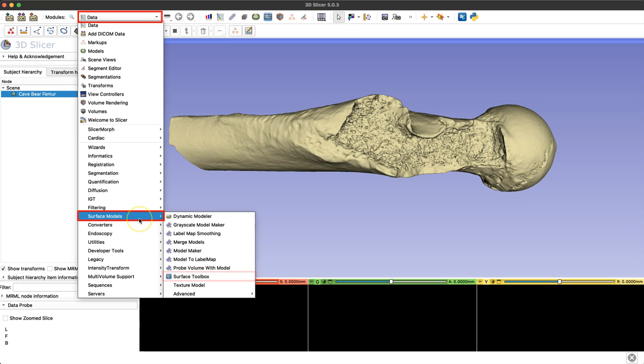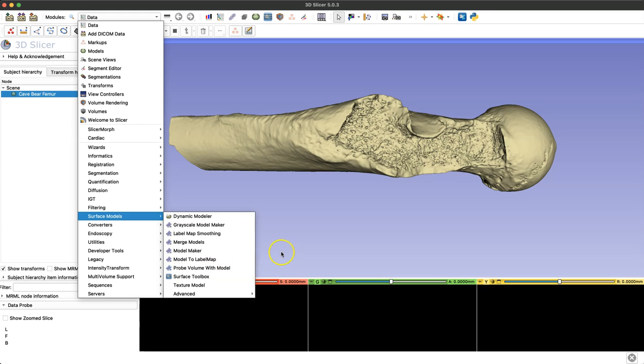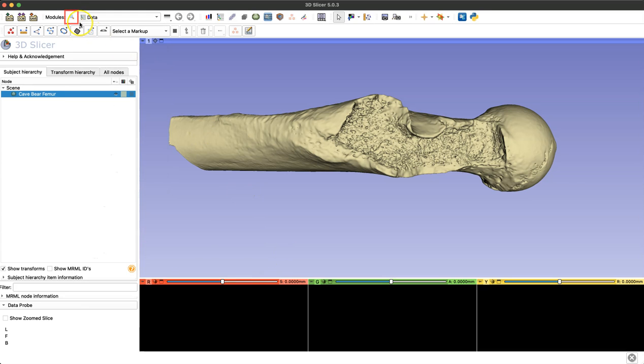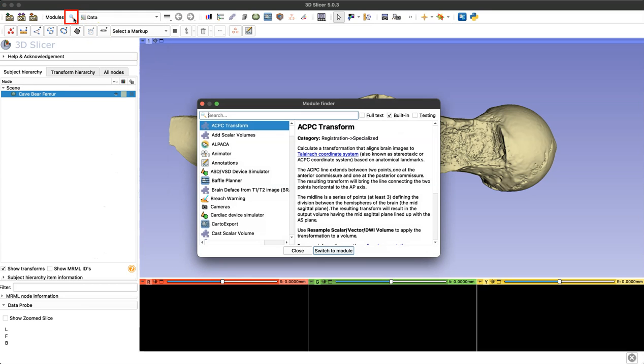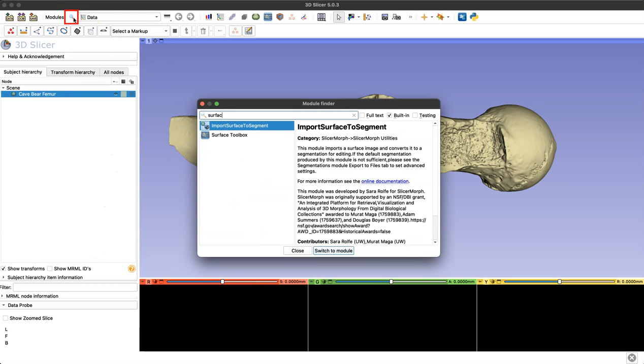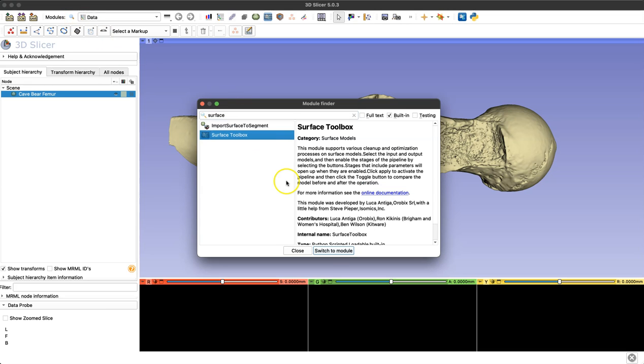You can either navigate to the right module by going to surface models and then surface toolbox, or you can simply click on the magnifying glass and type in surface toolbox. This is the module we're going to be using today.